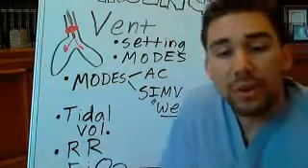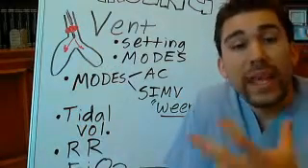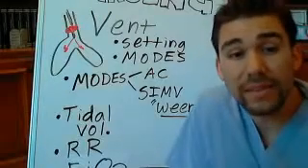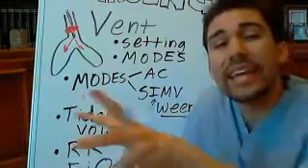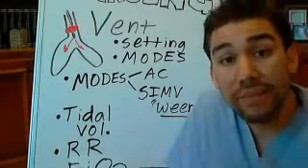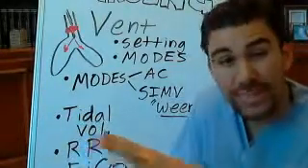We're kind of decreasing the vent, and your patient's going to hopefully start breathing by themselves. This weaning mode is putting the patient in control of the respirations and taking the responsibility of pushing air into the patient's lungs off the ventilator itself. Does that make sense, hopefully?